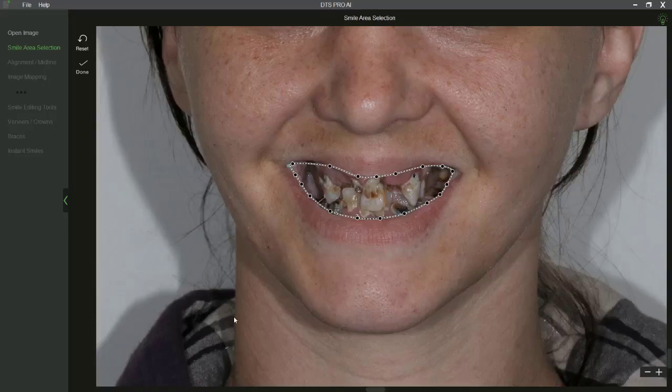in aesthetic work or comprehensive dentistry, I would sit there and do a simulation with them, because what happens is when they see what could be accomplished in their own face, I mean, you don't have to sell the case anymore. The case will sell itself. They will find the money and want to move forward with treatment.